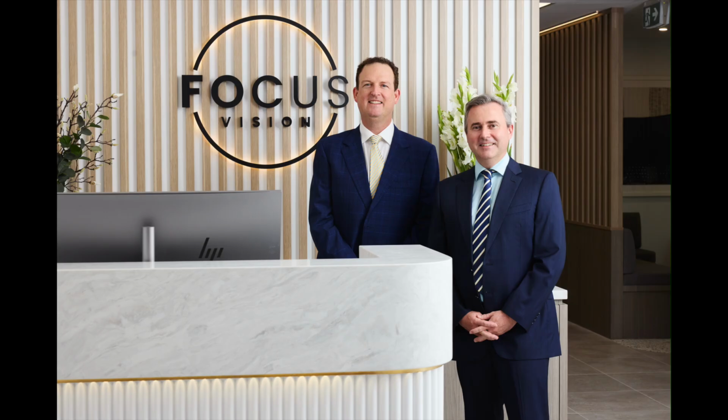Working on the CAIRS Plan tool has been somewhat of a labour of love for Dr. David Gunn and myself. We're very proud to present this enormous update to you. We hope you find it a useful tool in your practice.